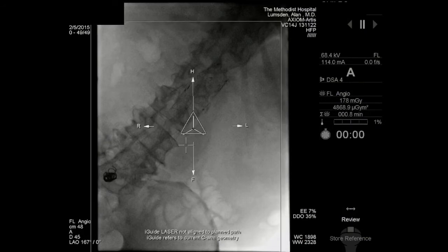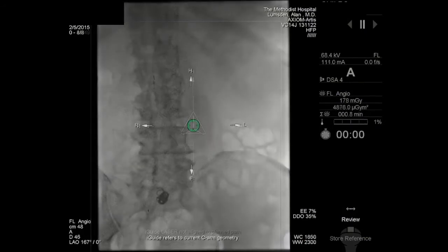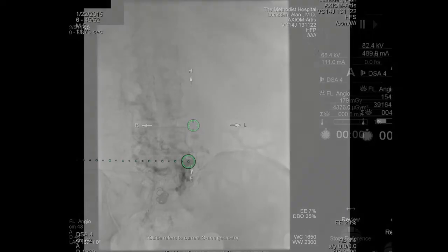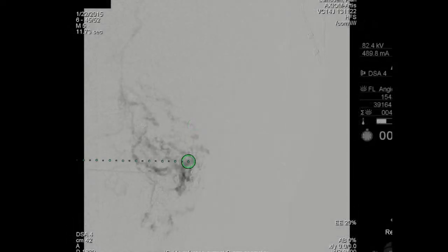Once that is done, we convert into what's called a bullseye view. That green circle is where the needle should be inserted, and we should be looking right down the trajectory of the needle.